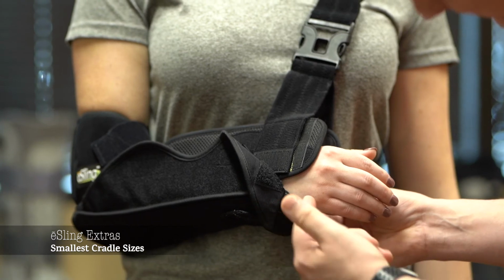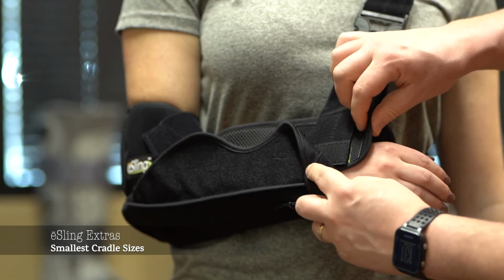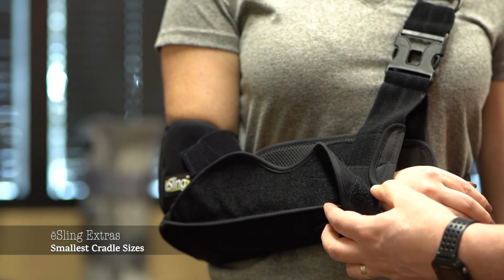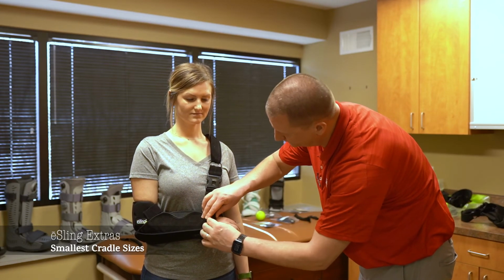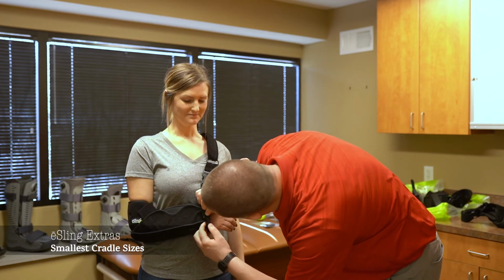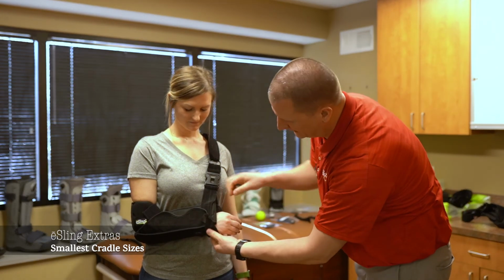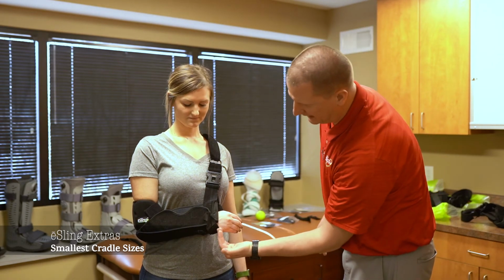because you want the cradle to be hitting before her knuckles into the mid-hand. You're able then to fold this back to make a nice collar here, which will stay sturdy to make it comfortable on the top portion of her hand. You would then readjust this, fold it nice and neat, and adjust the Velcro, which is on the back side, securing the strap on both sides. So thus now you have a nice collar through the mid-hand, in the front and the back, optimally sized for comfort.